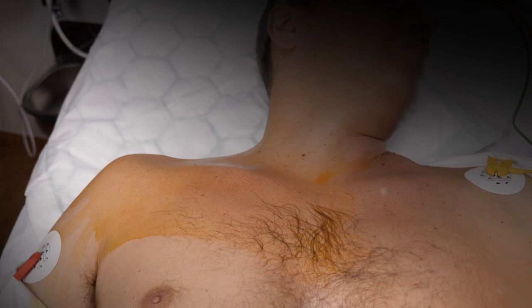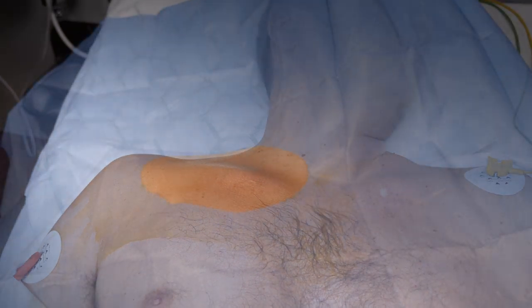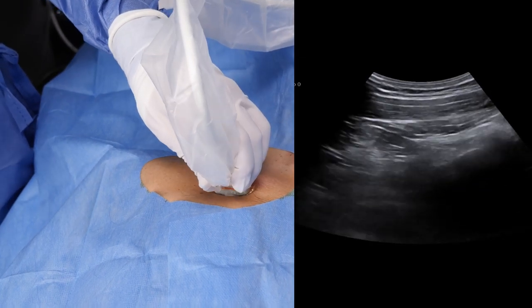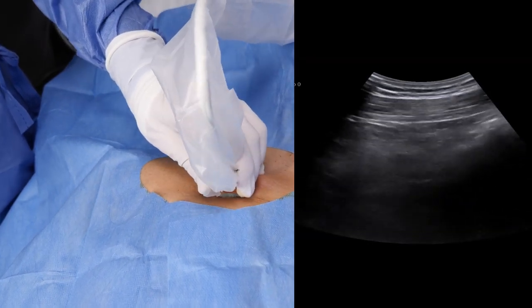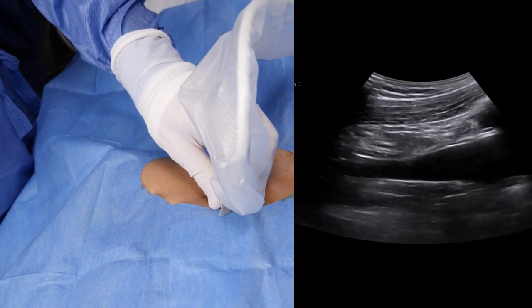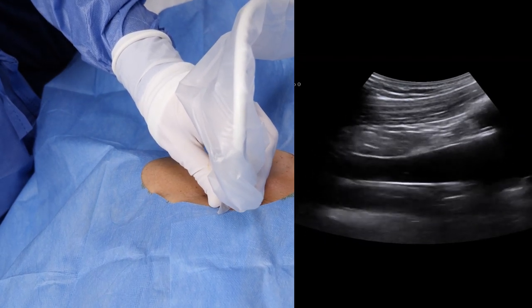Drape the patient and make sure to leave some space on the neck above the clavicle. Position the probe as far medial as possible, where the diameter is the largest and the vessel is less prone to collapse. This is especially important in the hypovolemic patient.